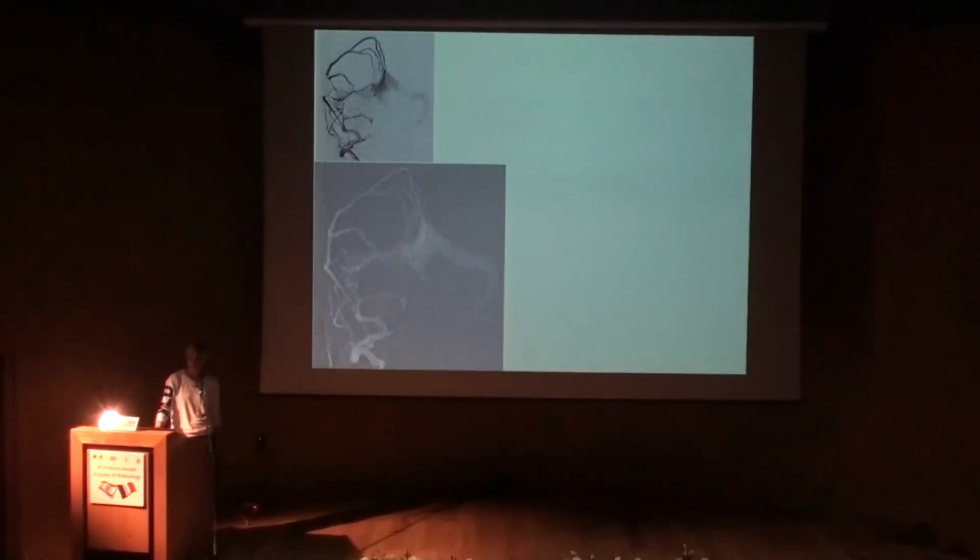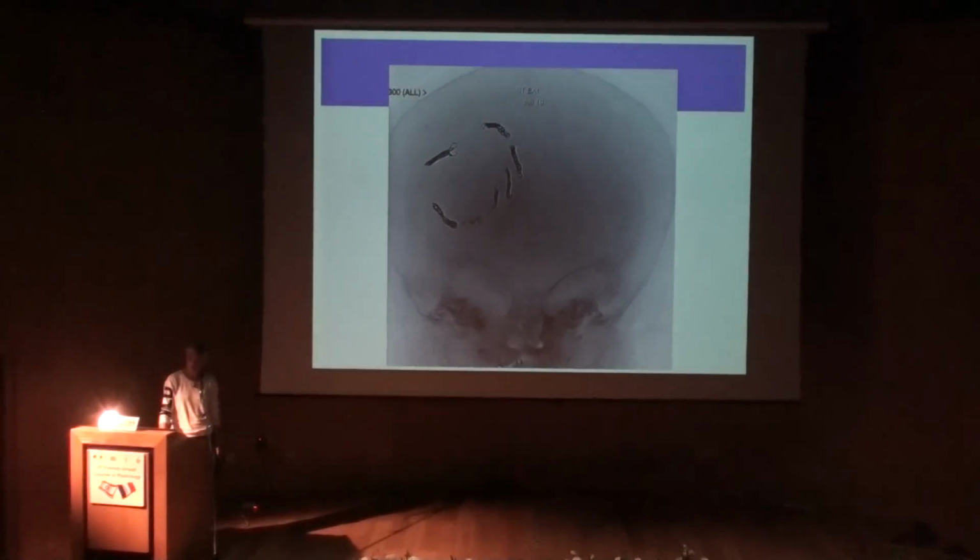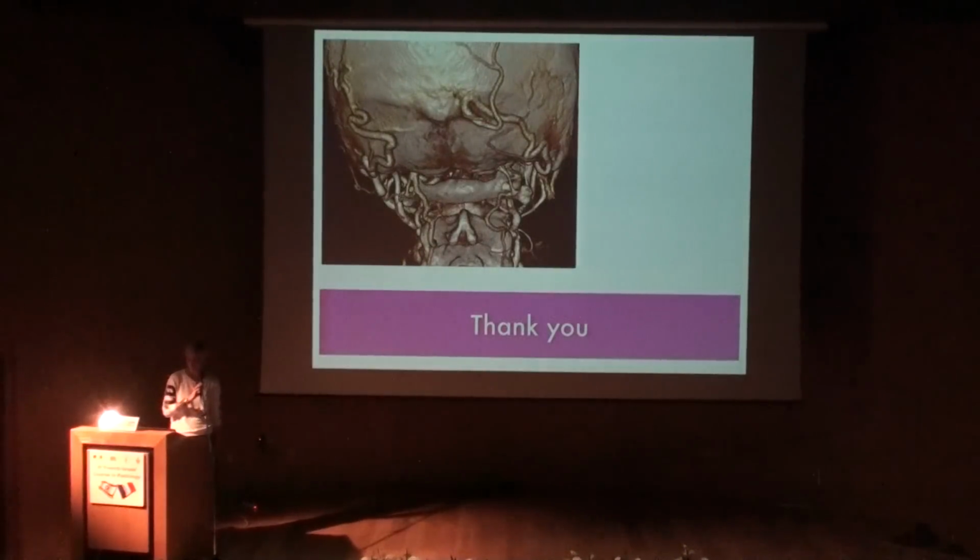And again, the difficulty of the treatment, we bring the catheters and we just go to every channel. And in this case, coils were put. And you see those images of the kids. There are a lot of coils in every vessel, and there's a little bit of glue here, trying to improve their prognosis. That's all. Thank you.